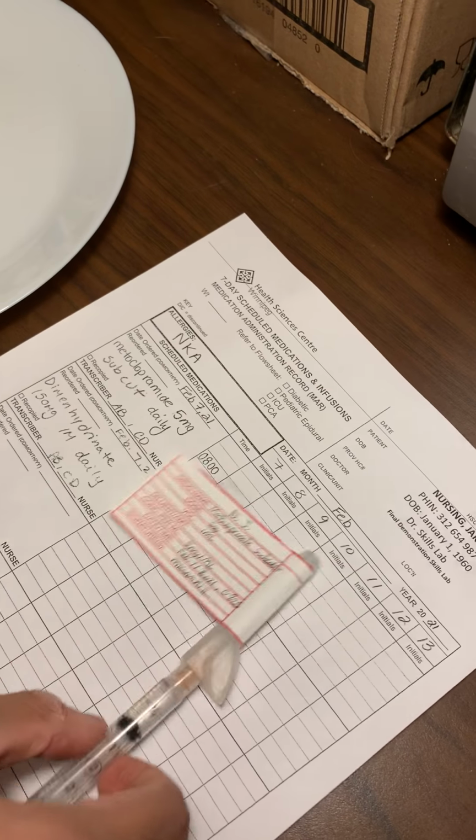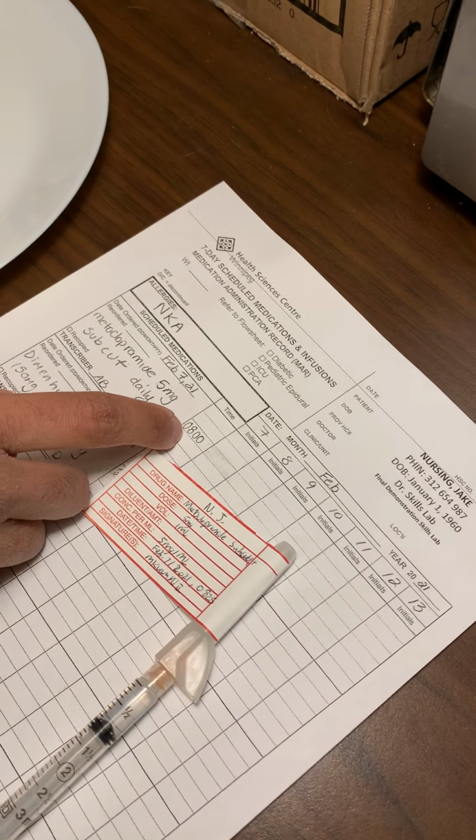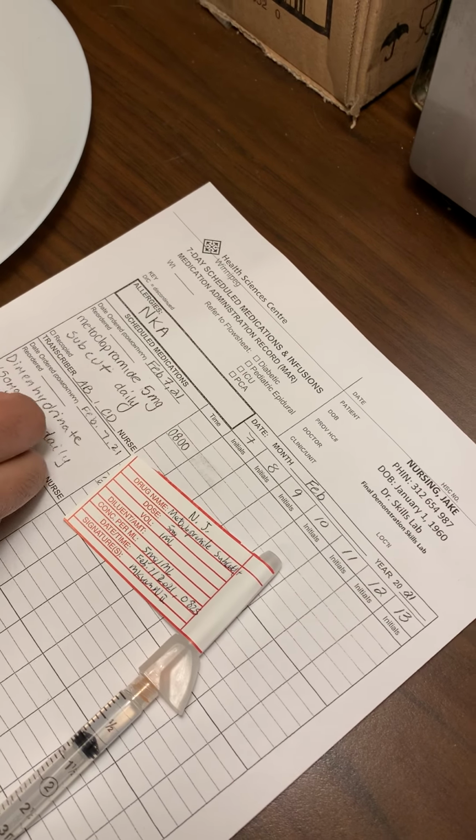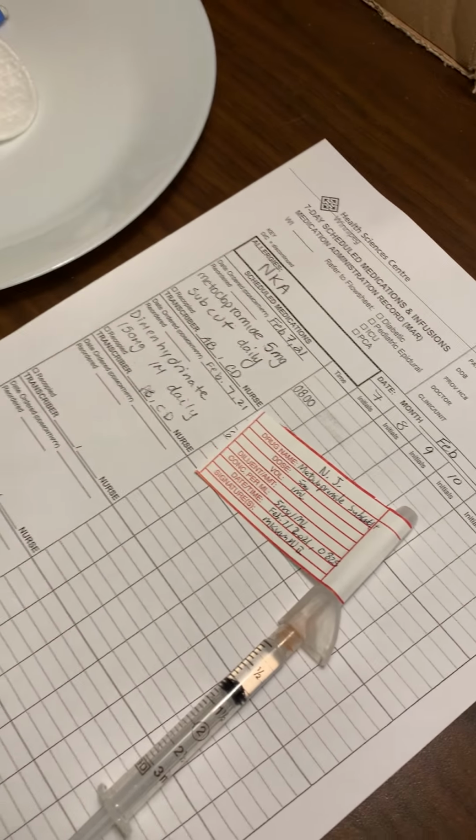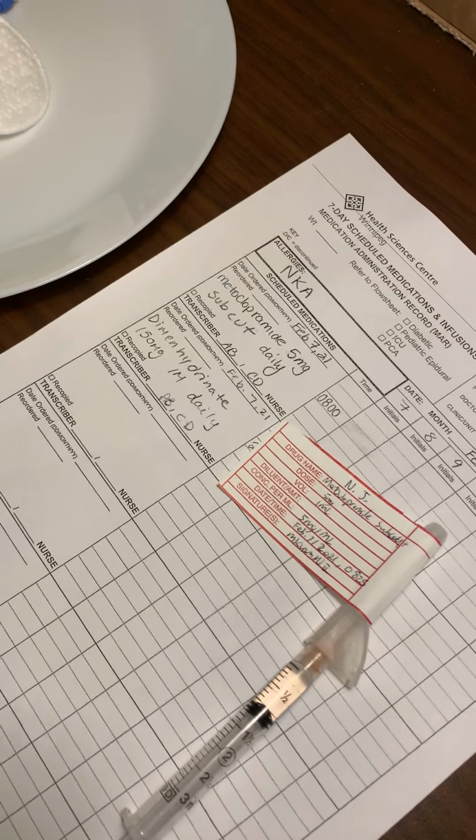And the time frequency of the medication is once daily at 0800. Right now the time is 0825, and it has not been given, so I can go ahead and give that. Okay, after I've done that, I can quickly go ahead and do some patient education with my patient. Okay, Mr.